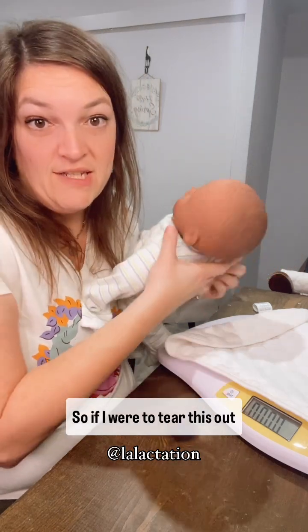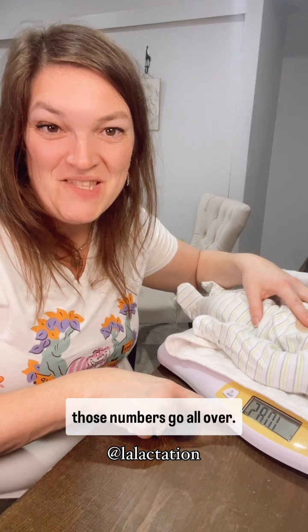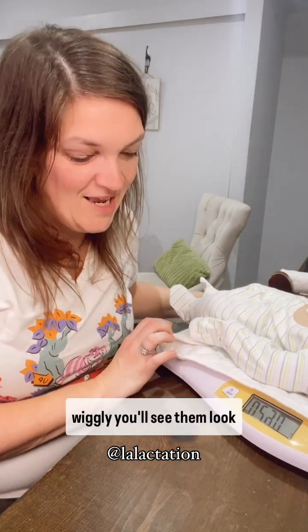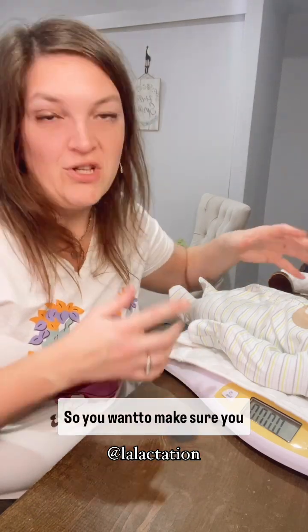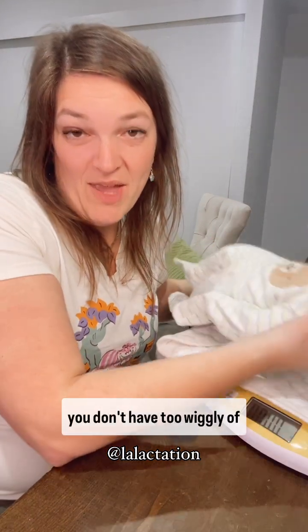So if I were to tare this out and mom is going shh shh, you'll see those numbers go all over. If the table is wiggly, you'll see them move — it's registering at 620. So you want to make sure you have a stable table, that the scale isn't wiggly and that you don't have too wiggly of a baby.